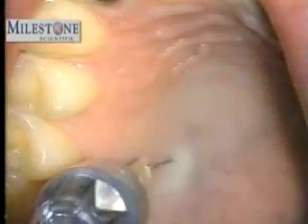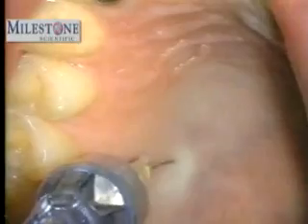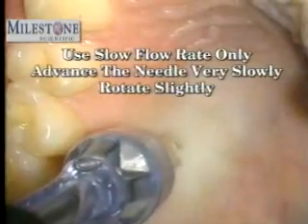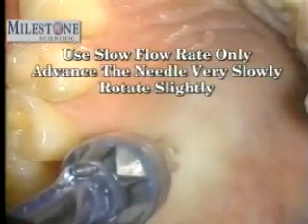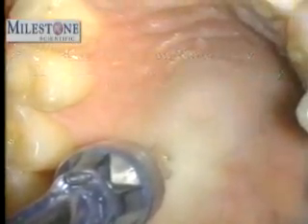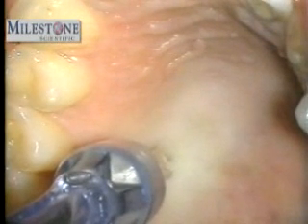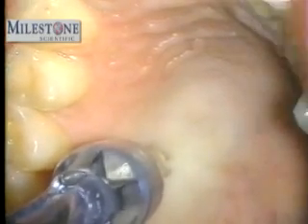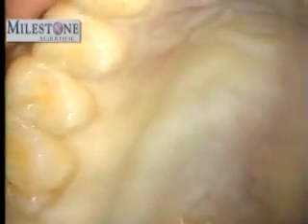Once bone is reached, perform an aspiration and maintain contact with the bone, aiming the bevel parallel to the osseous surface. Maintain pressure of the bevel against the bone. Listen for the cruise control sound and reactivate cruise control. Deliver 3/4 to 1 cartridge of anesthetic at the slow flow rate. Once the dosage is delivered, remove the needle and look for blanching.